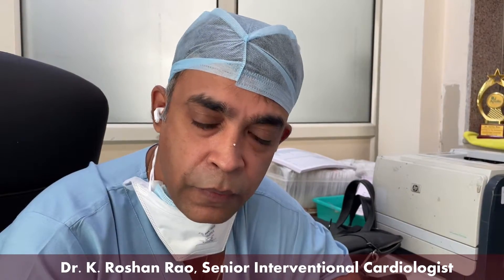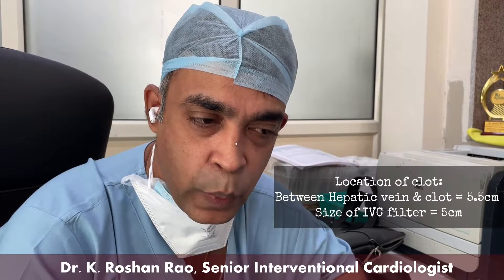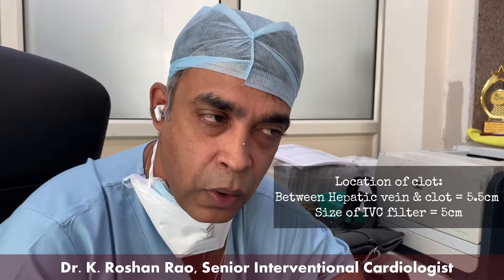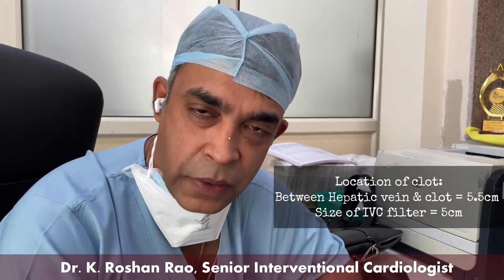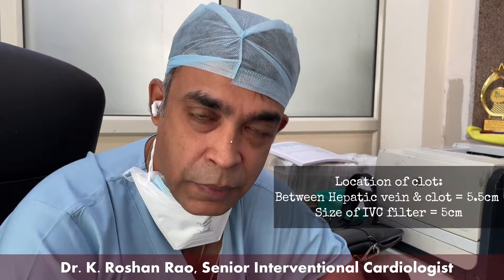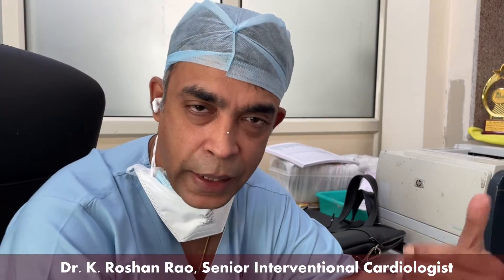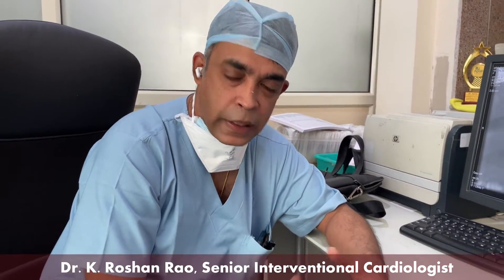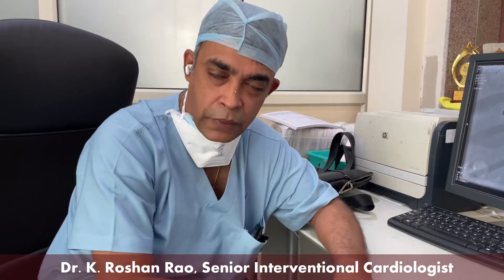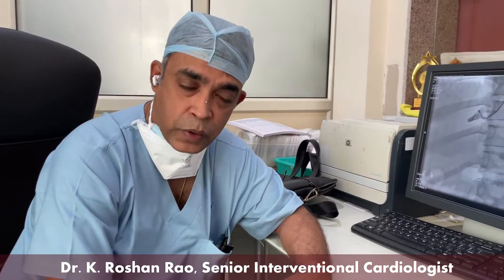The issue in this case was where and how to put an IVC filter. We did an ultrasound and found that the hepatic vein and the junction of the clot was around 5.5 centimeters. Our IVC filter is around 5 centimeters, so there was a potential space, because we never want the spike of the IVC filter to go inside any vein as retrieval becomes very difficult.